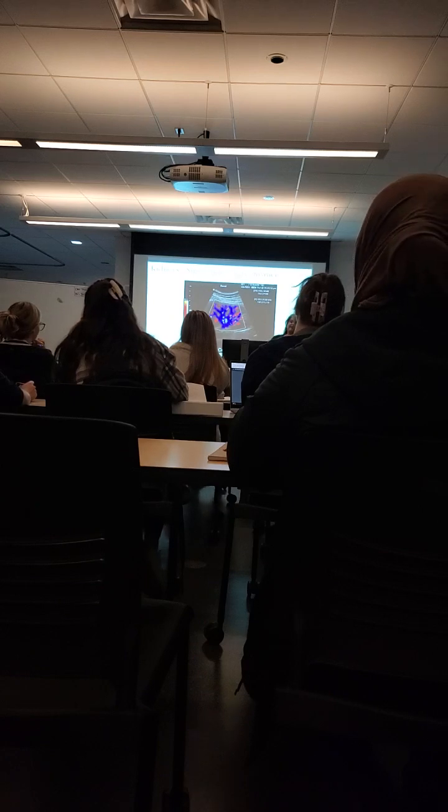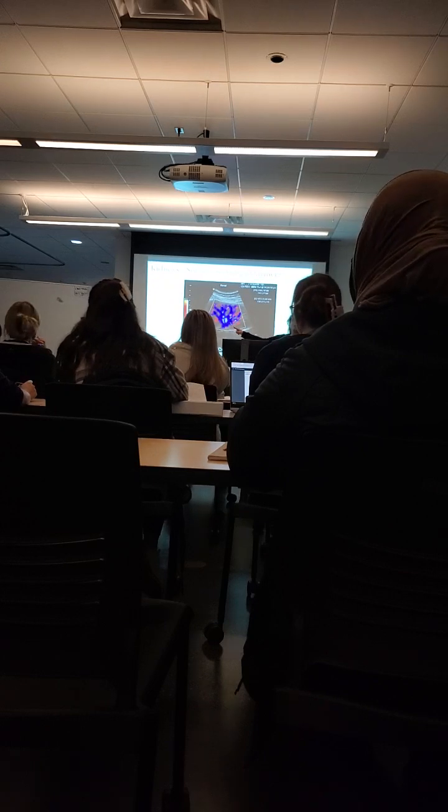And sometimes they have a color penetration button. I know the IU-22 does. And you can hit that little penetration button, and sometimes it still won't help. So sometimes you just have to use physics, and even if you've tried all your tricks, it's still not going to light up. So you just want to get some color.